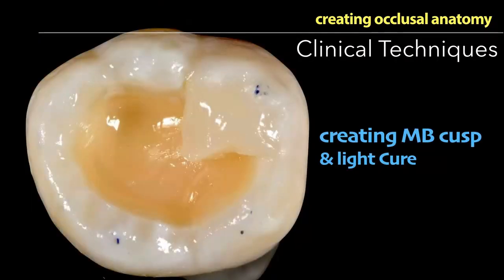In the mandibular molar, you have 5 cusps. The biggest one is the mesiobuccal, then the mesiolingual, then the distolingual, then the distobuccal, and then the distal. The easiest cusp to model is the mesiobuccal one. Keeping the anatomical landmarks in mind, take an increment of composite, place it along the cusp and model it with your spatula.